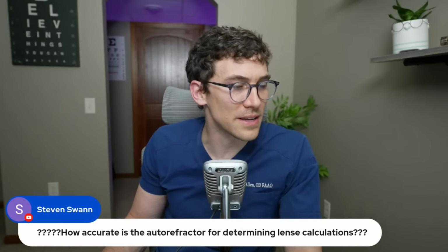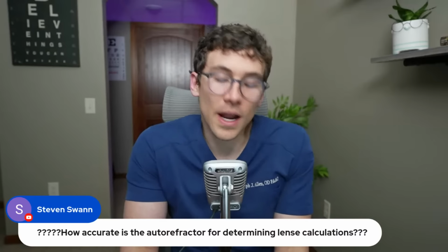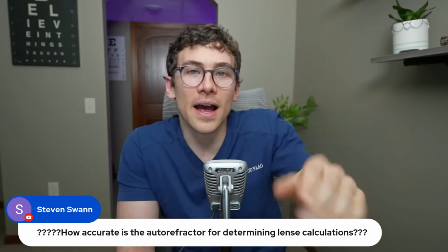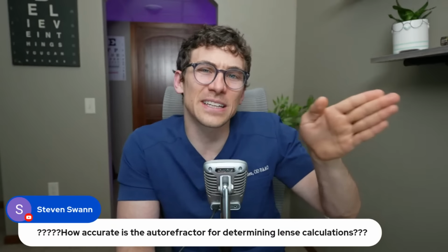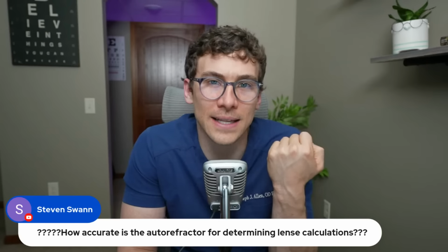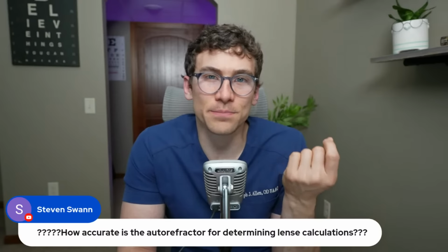Ooh, good question from Steven. How accurate is the autorefractor for determining lens calculations? An autorefractor, for those who are unaware, is an instrument we use in the clinic. It shines light into your eye, hits the retina, and bounces back towards the instrument. Based on how that light is bent by the structures of your eye, it can get a guesstimation of something that's needed, like your glasses prescription. So, I've never seen an autorefractor that's perfect.